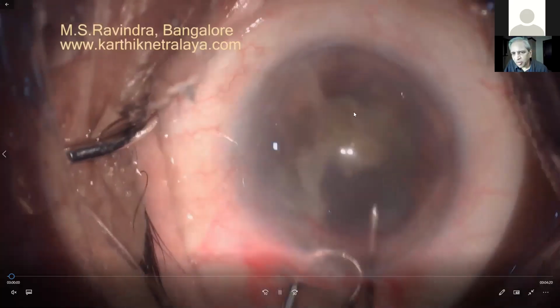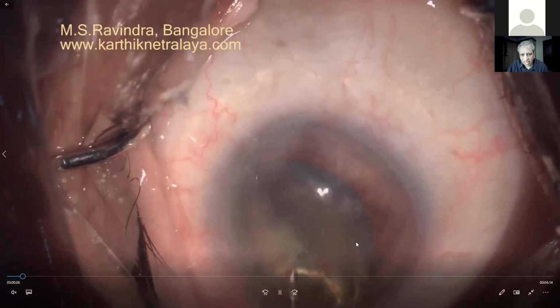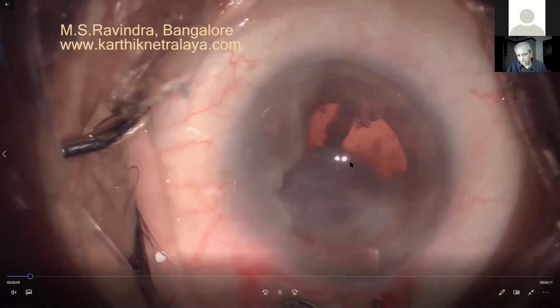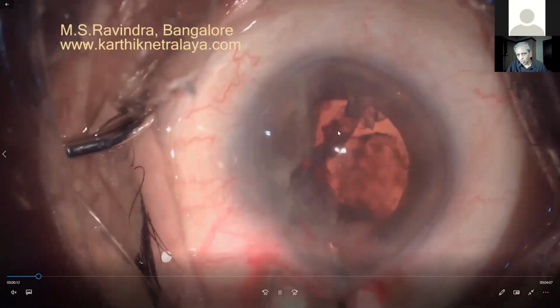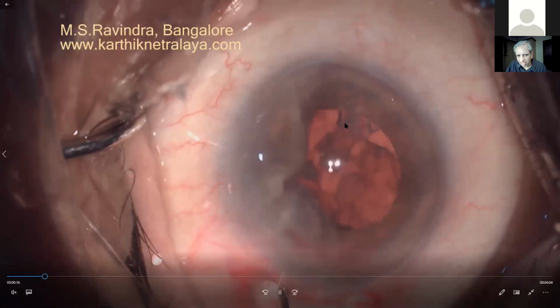Here, I've already noted that there is a large zonular dialysis in this hypermature cataract. I've bisected the nucleus. I'm very carefully removing the nucleus. I would have enlarged the tunnel in such a situation to avoid damage to the endothelium. And now you can see the entire capsular bag herniating. My main intention at this point of time is to avoid cortex or epinucleus and nucleus dropping backward. So I will not deepen the chamber too heavily. Just enough viscoelastic is used so that these pieces should not go inside into the vitreous cavity.